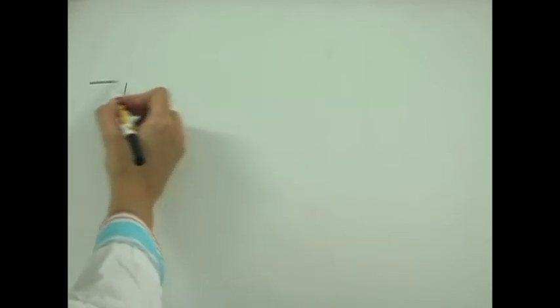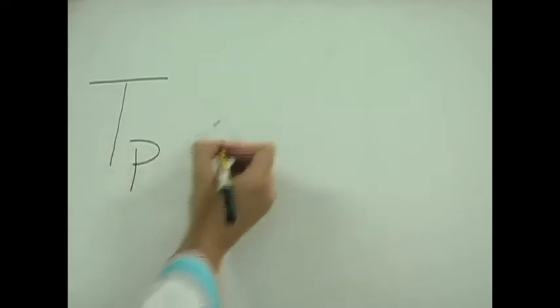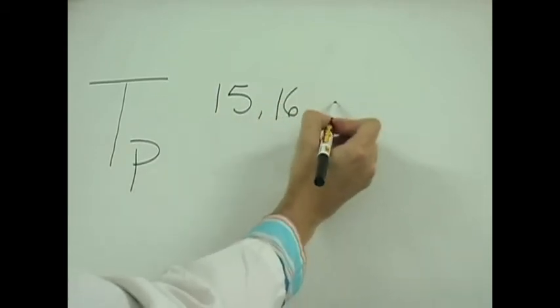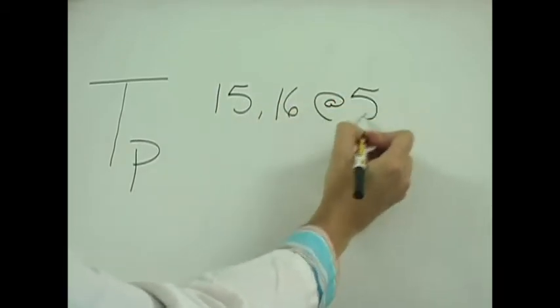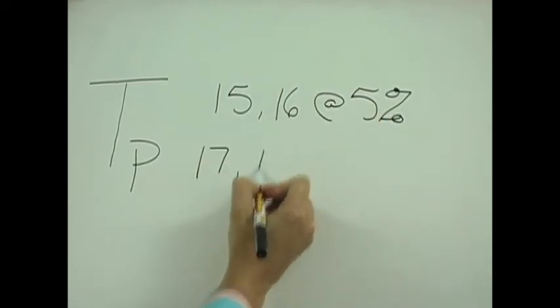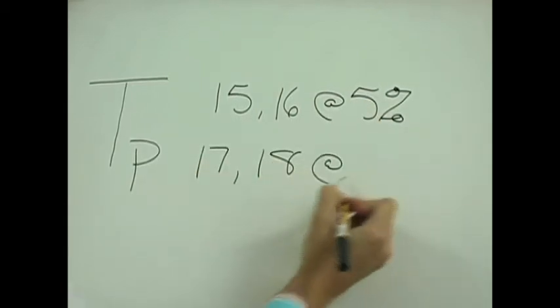It is best to get two IOP readings for each eye and record both. Measurement should be repeated until both recordings have less than 5% error. If this cannot be obtained, you should record the amount of error in your exam note. When recording the IOP, conventionally the right eye is listed first, followed by the left eye.